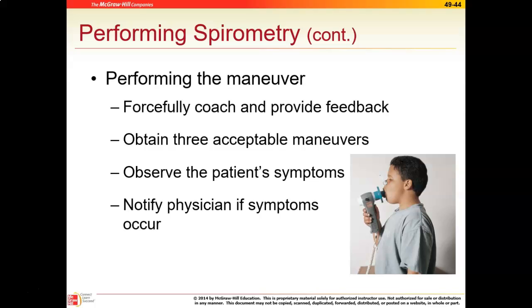Okay. So you're generally going to have the patient perform the test 3 times. Hopefully all three are acceptable, but you need 3 acceptable maneuvers. And so you may have to have the patient repeat the test until they get 3 acceptable ones. And the machine that you use will actually tell you if the maneuver is acceptable or not. Okay. Observe the patient to make sure they're not dizzy or lightheaded. And you can see here that this boy has a nose clip. Generally, positioning is important. You want to make sure your chin is up and pointed outward a little bit. They're going to take as big a breath in as they can, and then they're going to blow hard out.